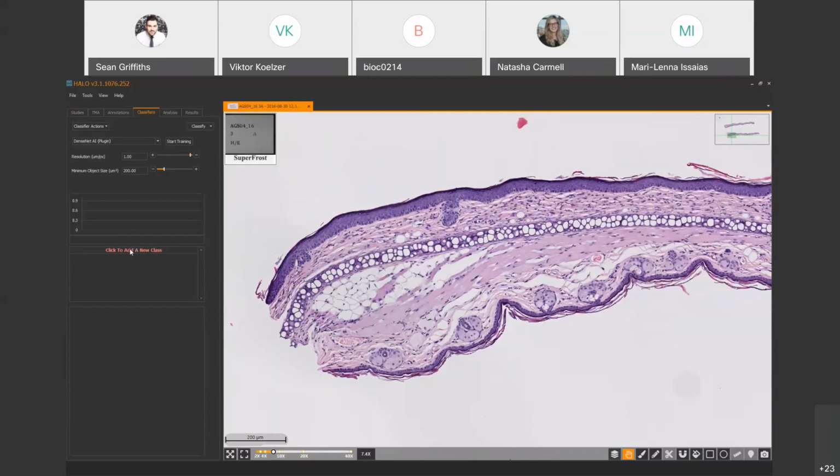Also, the order is important. So you generally put the most important class last, the background class first. So I could, for example, in this put the dermis, and then start with the epidermis, cartilage, sebaceous glands. Remember, in this example, the user wanted the sebaceous glands. She wanted to count them without having to manually annotate them.